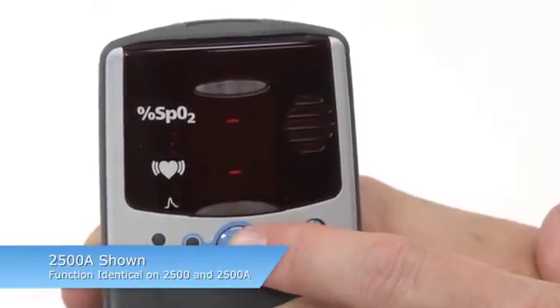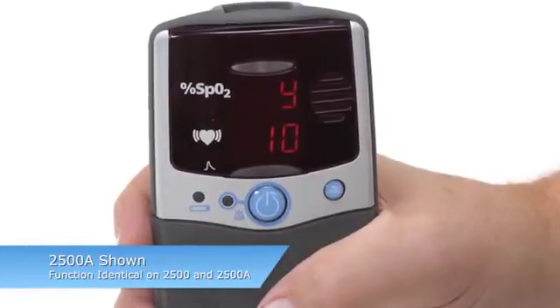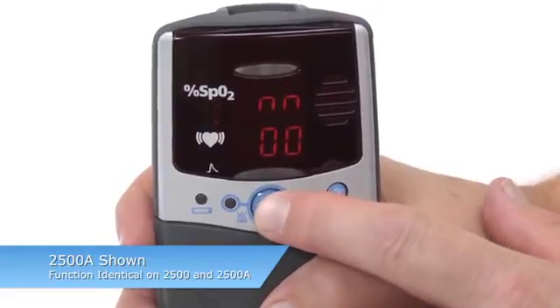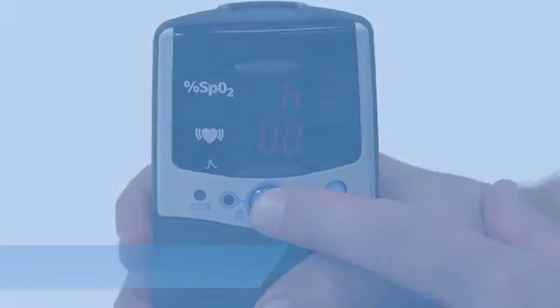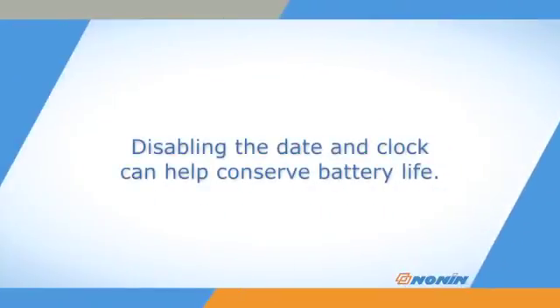You can disable the date and clock settings by setting the month to 00. If you confirm that setting, you will immediately exit Setup Mode. Disabling the date and clock can help conserve battery life.